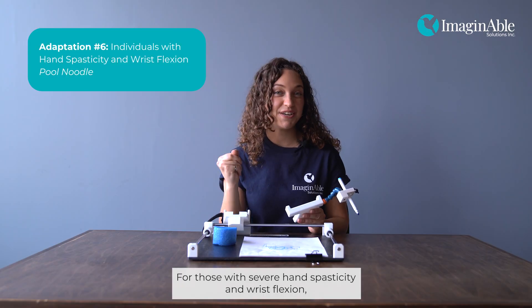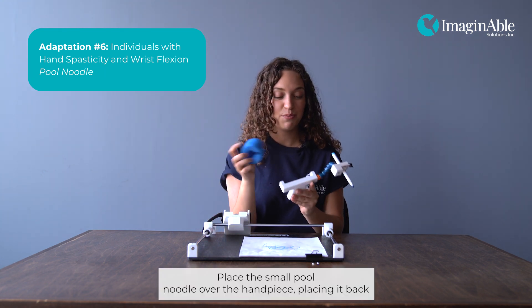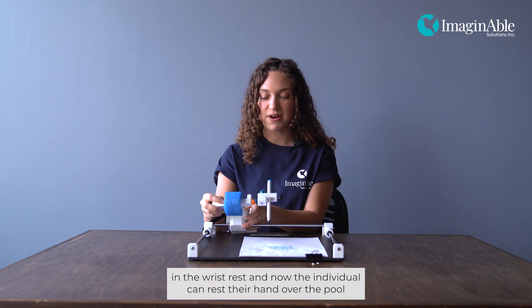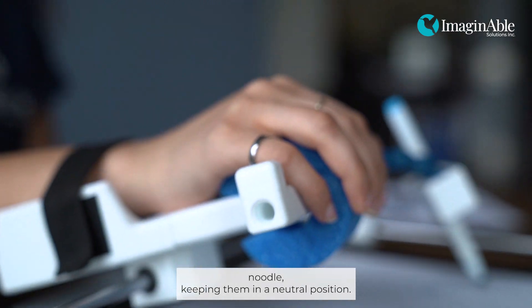For those with severe hand spasticity and wrist flexion, our large flat handpiece is the most commonly used. Place the small pool noodle over the handpiece, placing it back in the wrist rest. Now the individual can rest their hand over the pool noodle, keeping them in a neutral position.